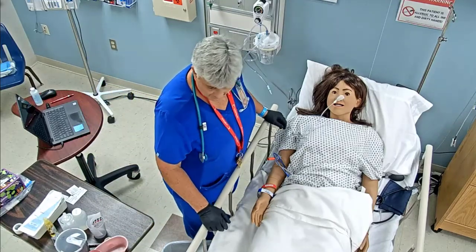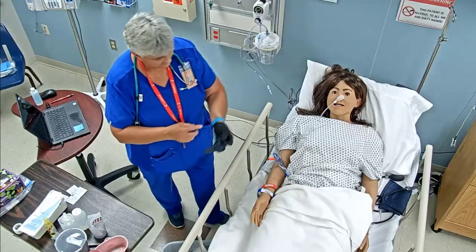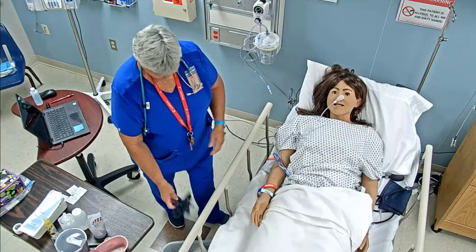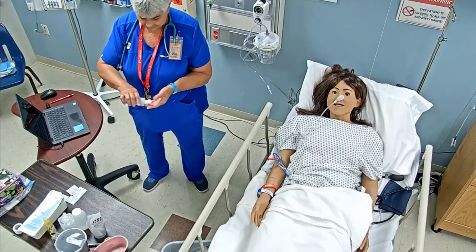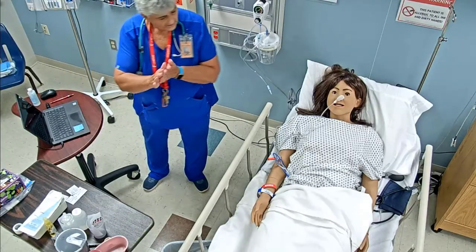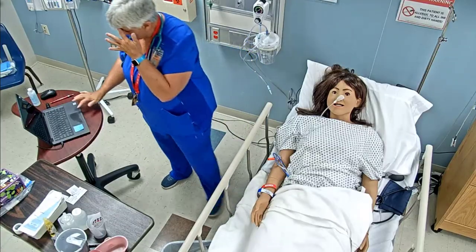Okay, so once we're done here, I'm going to take those gloves off again, glove to glove, skin to skin, do my medical hand wash, and then I'm going to go over here and document.